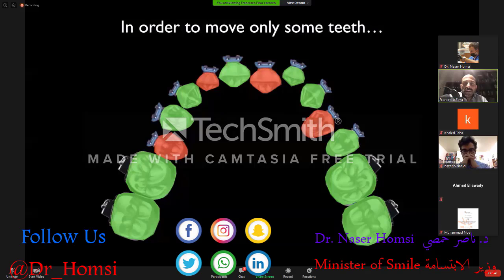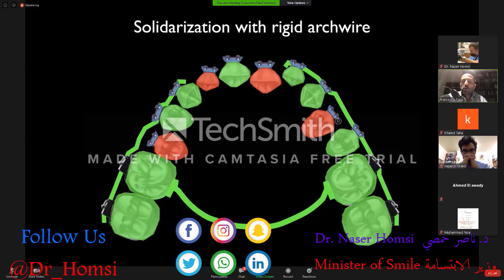Should we decide not to move some teeth, we could decide to join them together with rigid wires. For example, 19/25 running on the incisors in the brackets on the buccal side, and a transpalatal arch running on the palatal side of the upper first molars. This could create a solidarization, a very rigid unit of the posterior teeth in a good position.